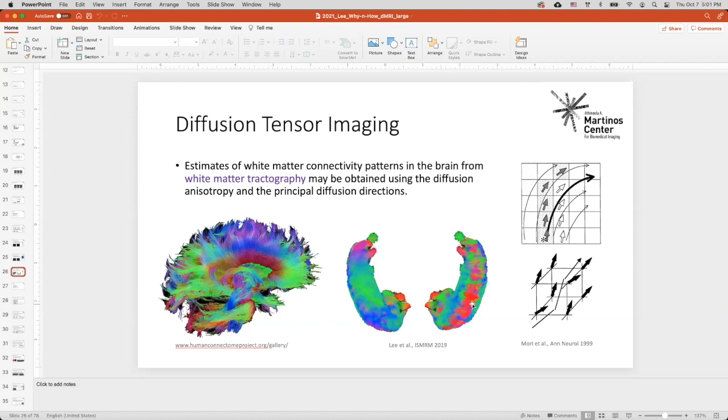And we can see these red chunks, like red fibers, they are obvious. They are fibers going posteriorly and going up and going out from the fornix. And in high resolution, we can see these red fibers are grouped into several clusters. And there are some hypotheses saying that it may form some functional units, but it's still a hypothesis. But indeed, we observe these groups in anatomy.